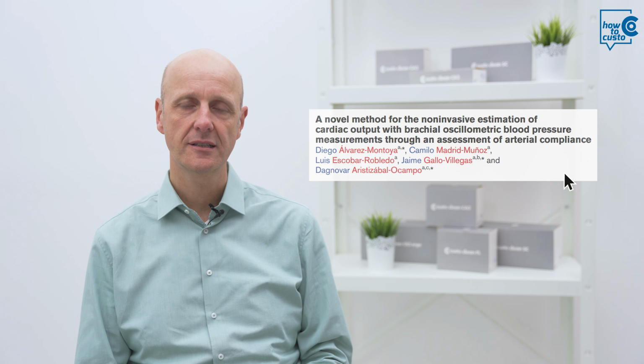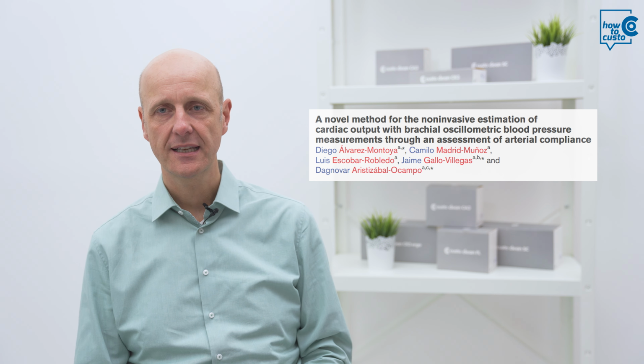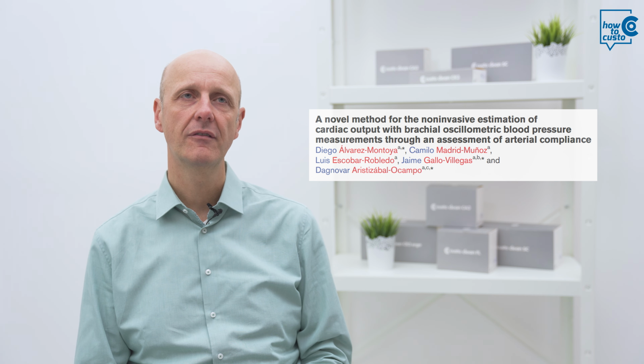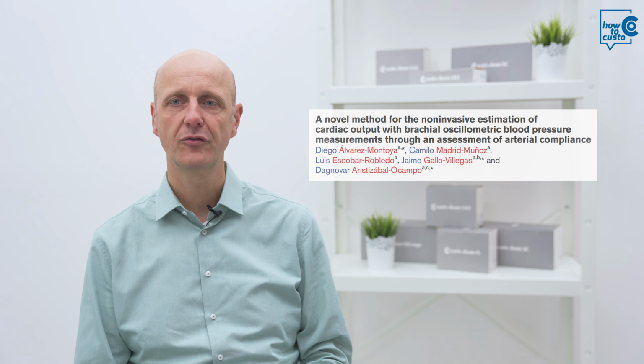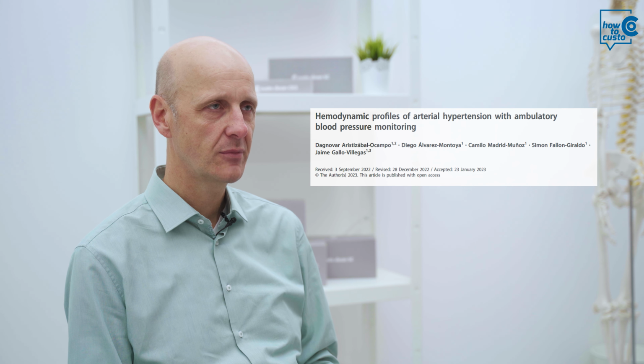Now, you will quite rightly ask yourself, is this even validated? And of course it is. Otherwise we wouldn't have integrated it into the software as an innovation. There are 2 key publications to be mentioned here. Firstly, the publication that deals with the validation of the method in 2021, validated and published by Alvarez Montoya and colleagues. And secondly, the publication of Aristizabal Ocampo and colleagues from 2023.